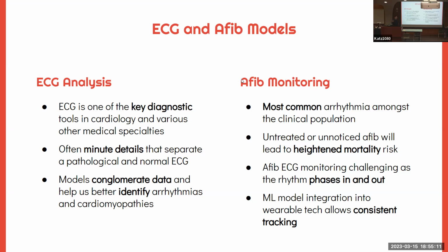So the accuracy of Apple's ECGs is probably not clinician grade, but it's helpful because, A, it proves the likely existence of AFib, so your clinician can do something about it. And it also gives them some idea of when this AFib is likely to occur. So they might be able to get it more accurately on lab testing by emulating the conditions. Like, if every time you go out for a run your Apple Watch says you're getting into AFib, they can ask you to run first and then take a scan. And if they're able to see that AFib clinically, then they can start treatment much sooner rather than later and improve your outcomes by a lot.